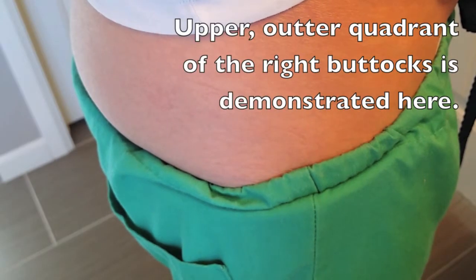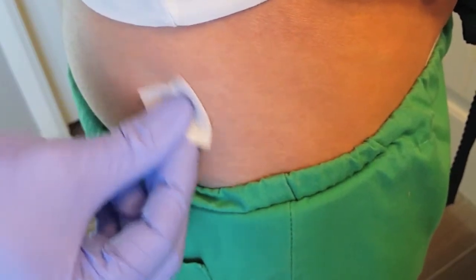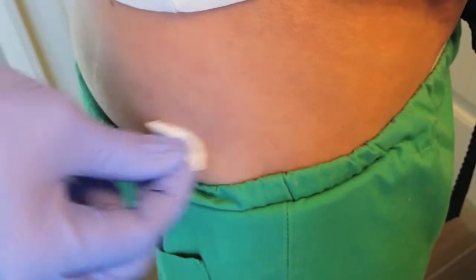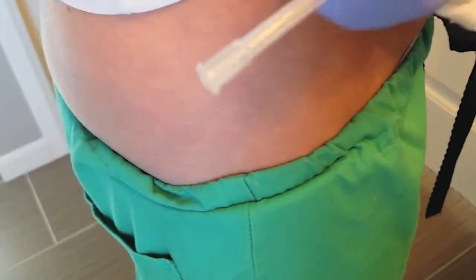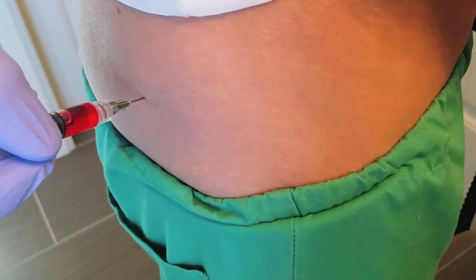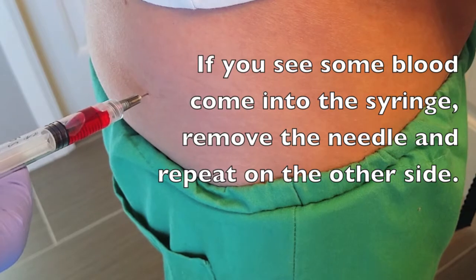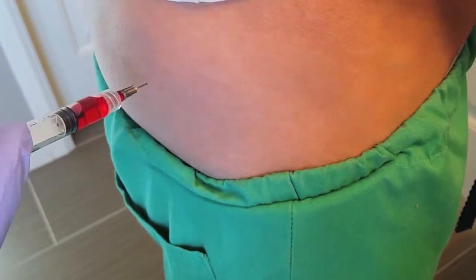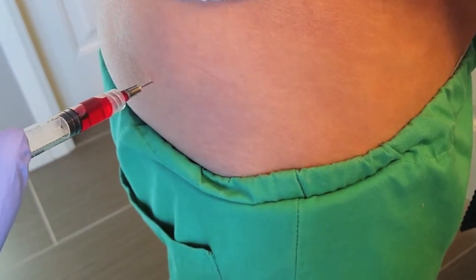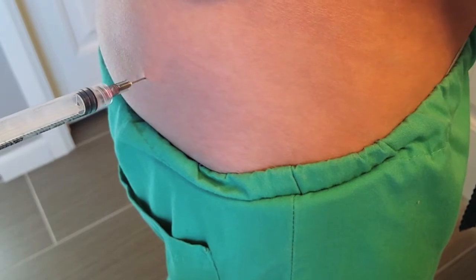Now that we have our injection prepared, we're ready for administration. First, we're going to clean the injection site with an alcohol swab, making sure to thoroughly clean the area. Next, we can uncap our needle. Most people do like to dart it past the skin. Once you're into the muscle, you're going to want to pull back on the plunger. You will likely see what looks like air coming back into the syringe; however, that's just a vacuum. If you do see a little bit of air for an intramuscular injection, that's okay. Next, slowly inject that into the muscle, and then remove your needle.